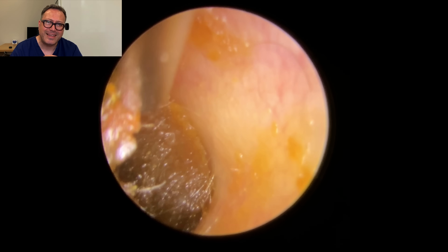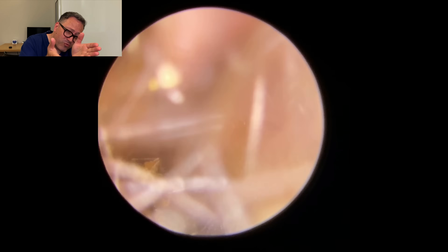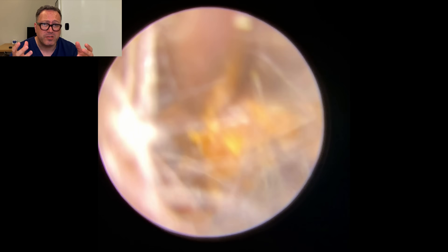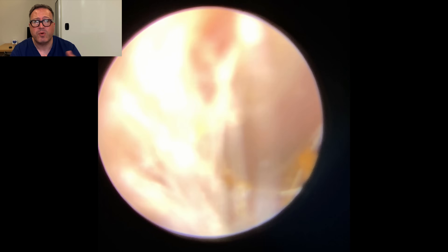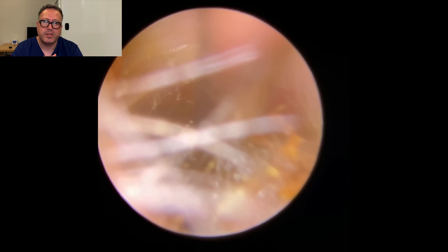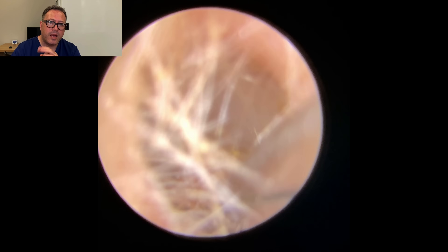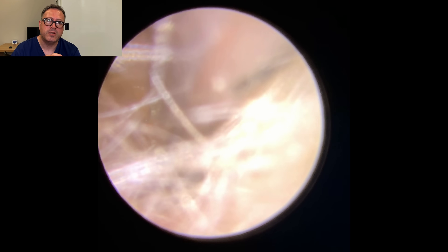Let's see what's going on behind that — you can see just how deep this has gone. That is literally the bottom portion of wax right against the eardrum. So you can see why this patient would have been having so many issues as far as hearing, and certainly an increased amount of tinnitus in here as well. All these things could potentially have been causing a lot of problems. And imagine if this had been left in here to dry out even further than it already had — it would have been an absolute nightmare to try and get out, and probably would have ended up being referred to the ear, nose and throat consultant.